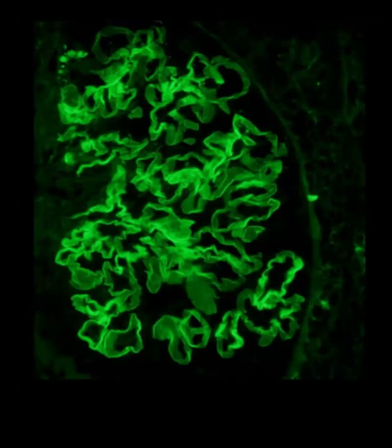Yes, doctor. Linear deposits occur in post-transplant patients, in a cadaveric transplant, in patients with diabetes, in patients with anti-GBM disease, and patients with fibrillary GN, and also rarely in lupus nephritis, as well as in light chain deposition disease. Okay. So whenever they give you this type of immunofluorescence, you should check the history, and you should put the diagnosis as one of the above said diagnoses.